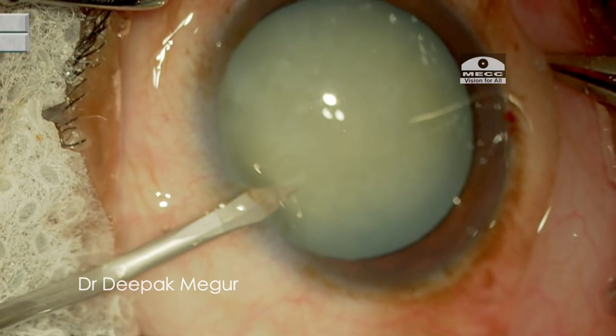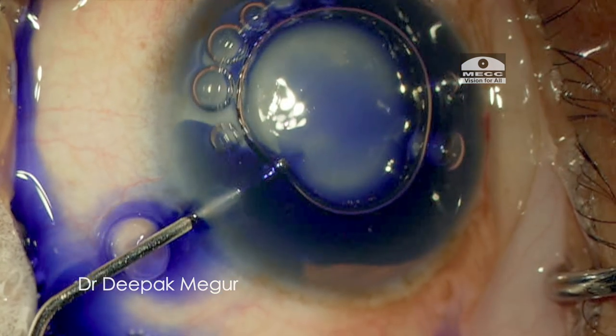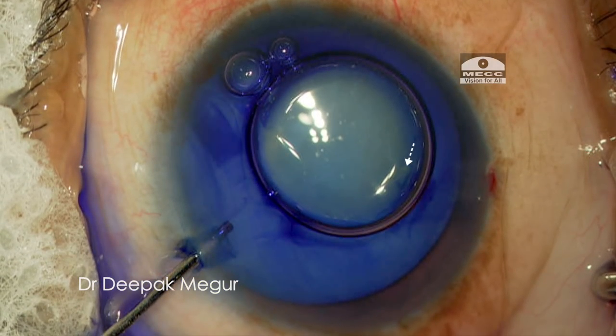With this suspicion still at the back of my mind, I carefully make the other side-port and then stain the capsule. Once the staining is done, the obvious is confirmed — we can clearly see the area of the anterior capsule puncture.